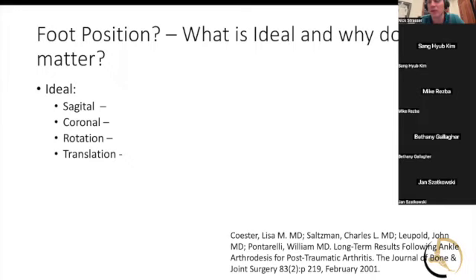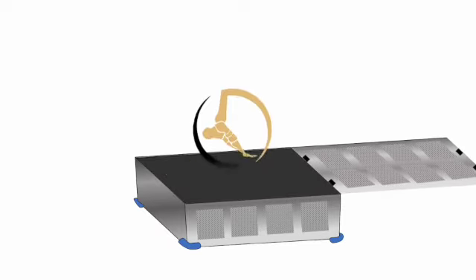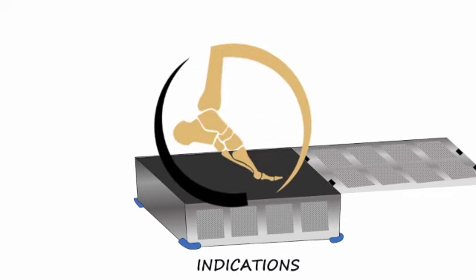How about you guys? Yeah, I look at the x-ray, but there's a lot of motion, like you said, a lot of times in the talonavicular. So as long as the x-ray matches my clinical exam, I'm okay with it. Yeah. But like you said, I would err on being a little more dorsiflexed than plantar flexed. Yeah, for sure. And a little more valgus than varus, for sure. It seems like they don't like the varus very much at all.